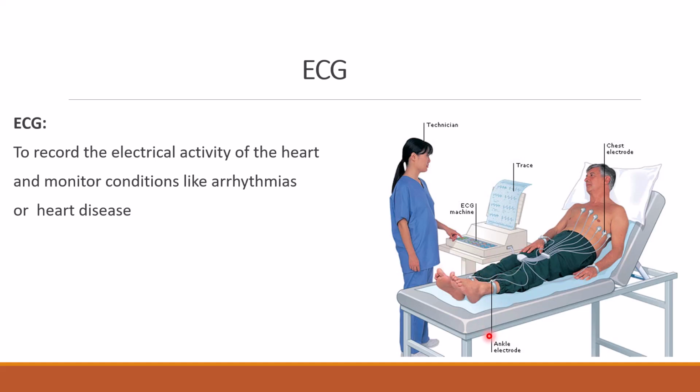Sometimes in home care it's important to just monitor the ECG, not in a continuous way like in the hospital, but for example every few days, just take the ECG and share the information with the doctor.